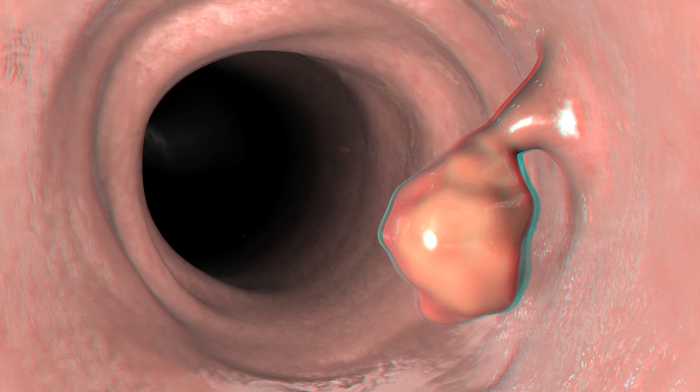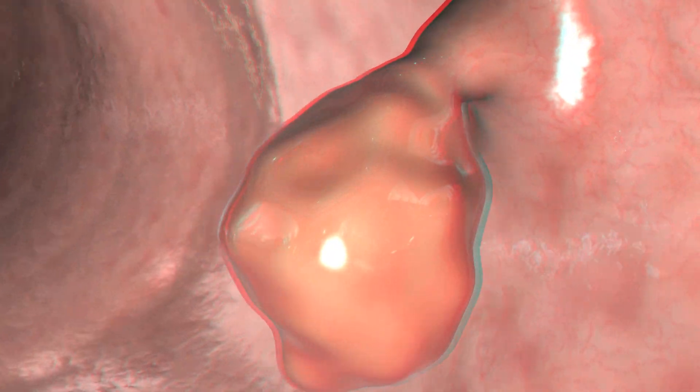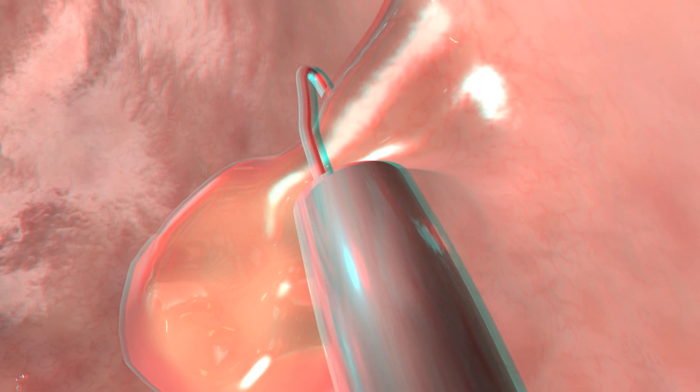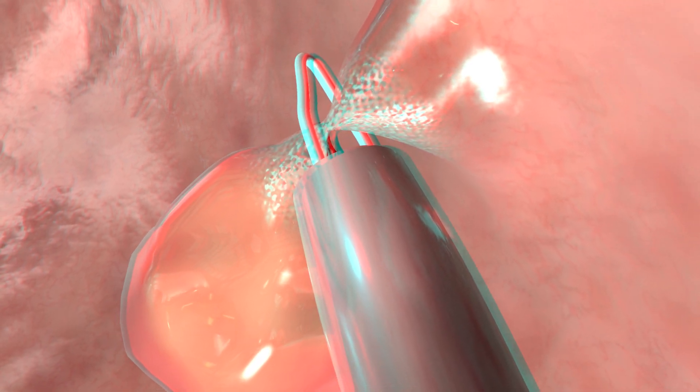If one or more polyps are discovered, your doctor will generally remove them in a procedure called a polypectomy. He or she will usually use a snare to remove the polyps and then cauterize their bases to control bleeding.